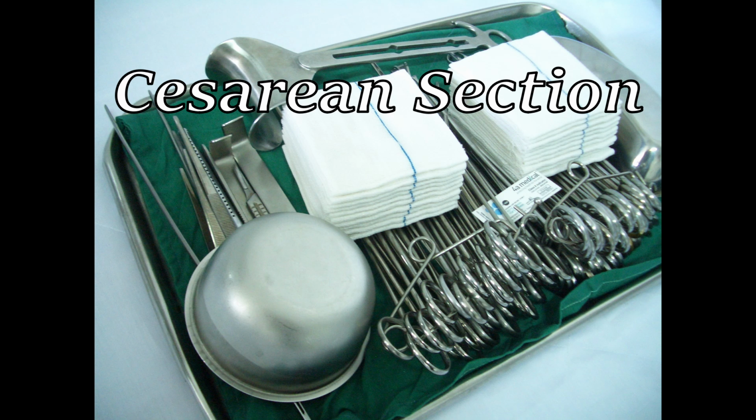Step 4. Delivery of the infant and placenta. The fetus is delivered manually, with gentle fundal pressure. In breech or transverse lie, special maneuvers may be required, such as the Patwardhan technique or internal podalic version. The cord is clamped and cut, and the neonate is handed to the pediatric team. The placenta is delivered by gentle traction on the cord and manual sweep. The uterus is wiped clean and inspected for retained fragments. Pearl. Always inspect for a succenturiate lobe or retained fragments to reduce postpartum hemorrhage risk.